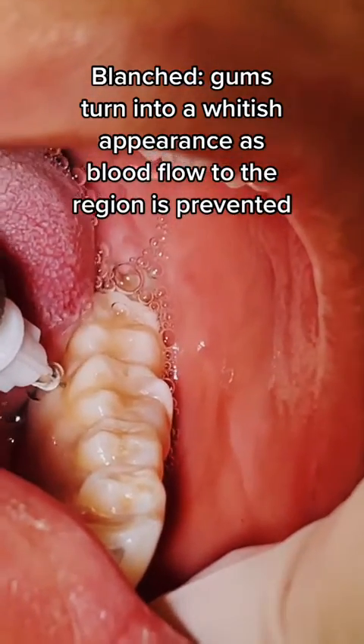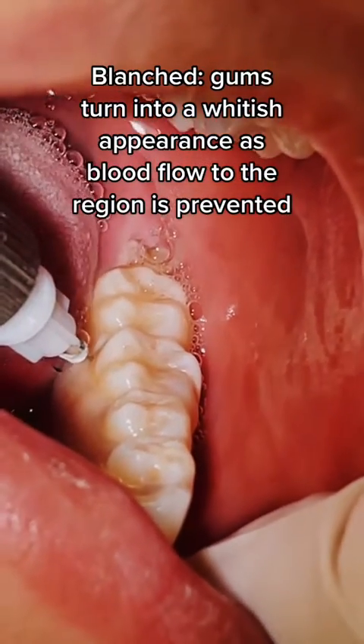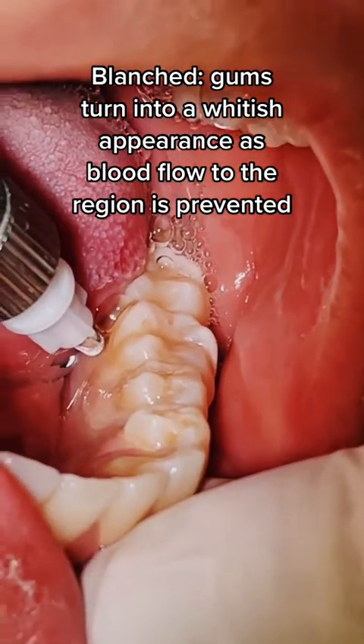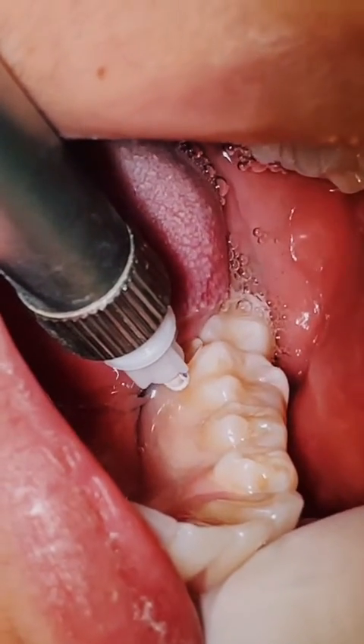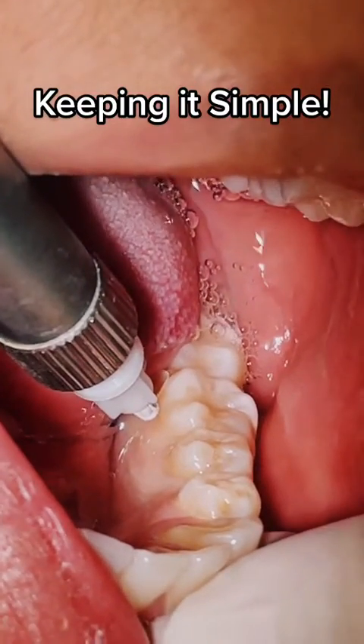She's not really reacting — I'm just dropping a little bit of anesthetic in here. Turn to your left. See how that looks? It's starting to blanch. I'm going really slow now. Could you go faster? Yes, but they'll feel it.